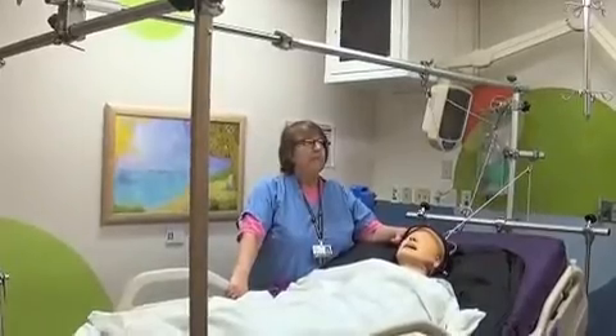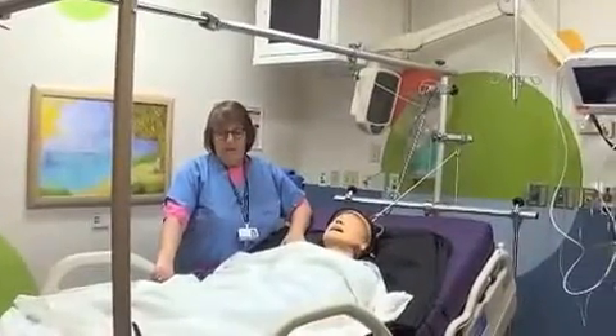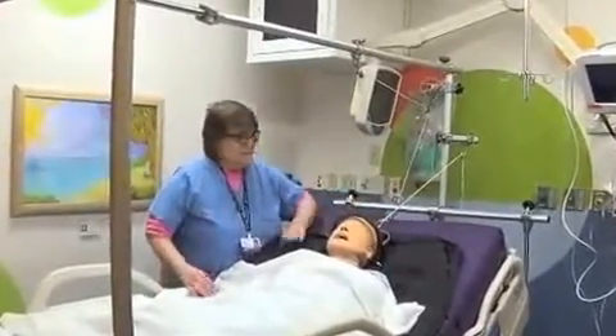They basically have two setups: they sit up at 90 degrees and angled for when they're in bed. The first thing you do when you walk in the room is make sure that the line of pull to their head is relatively straight.